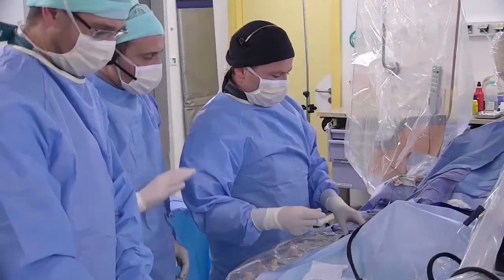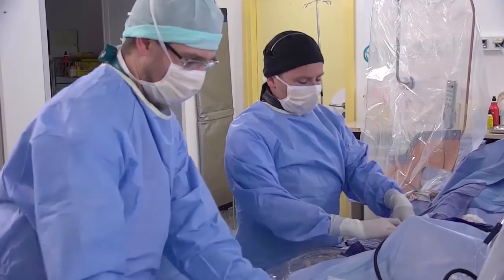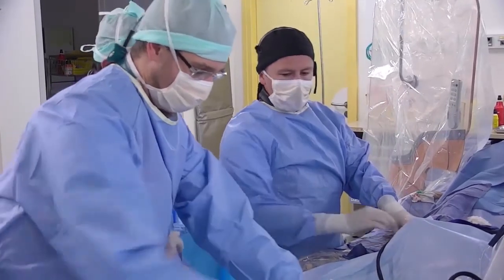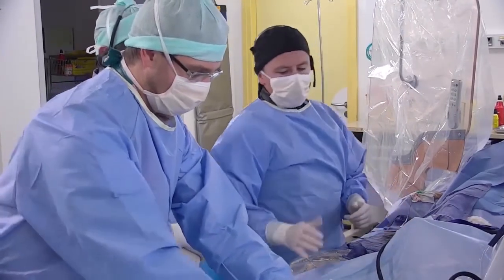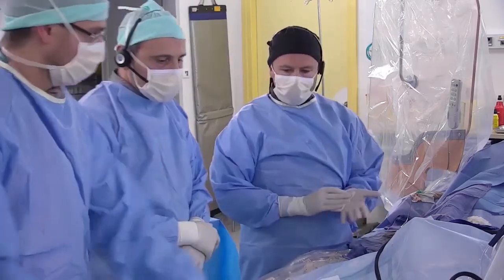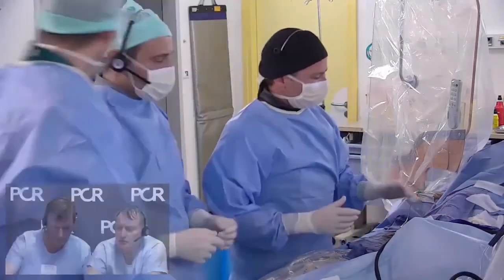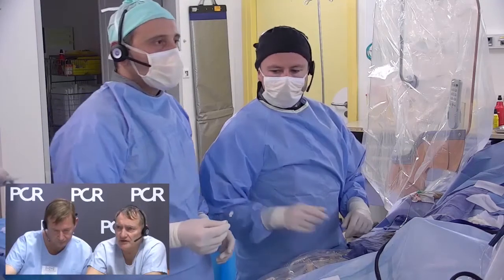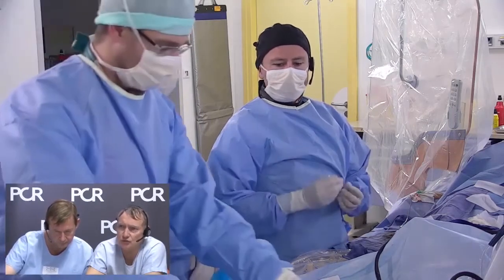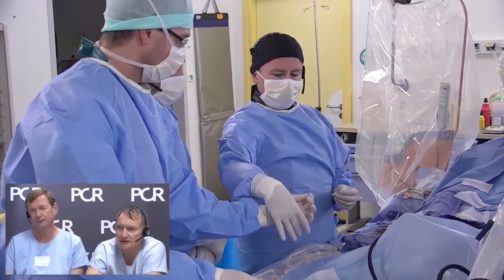So the decision is to stop with 1.5 millimeter, right? I think it's okay because there is not a lot of friction in the distal part. And it was not so difficult to cross this lesion. This is my opinion, that the lesion is well prepared. Do you think that with a burr of only 1.5 millimeters, that's enough for the left main, or do you prefer to change to a bigger burr?